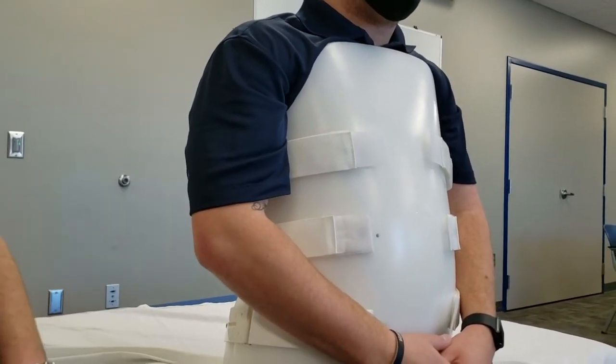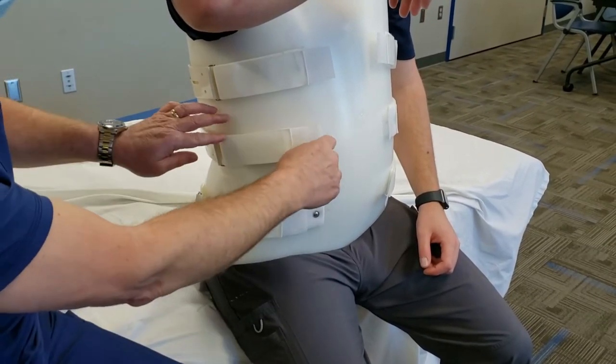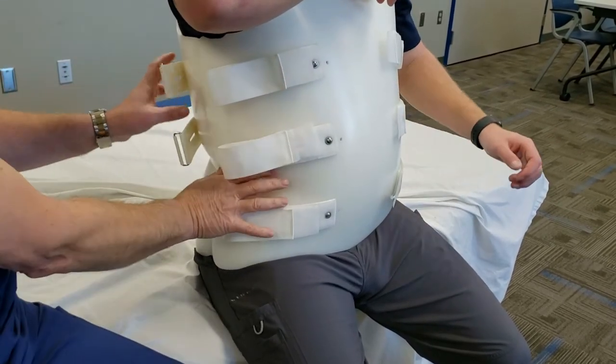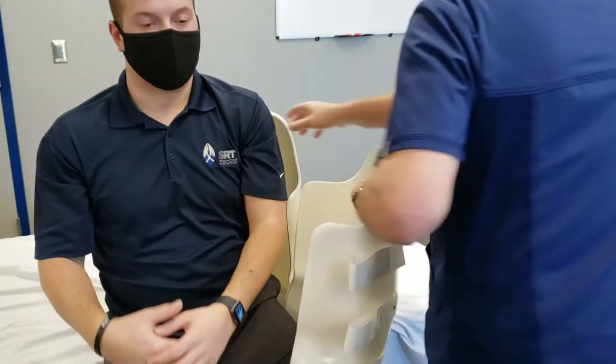And there we have it. To doff it, you would just take three straps on one side, putting the belt back against itself, and just open it up like a clamshell and remove it.